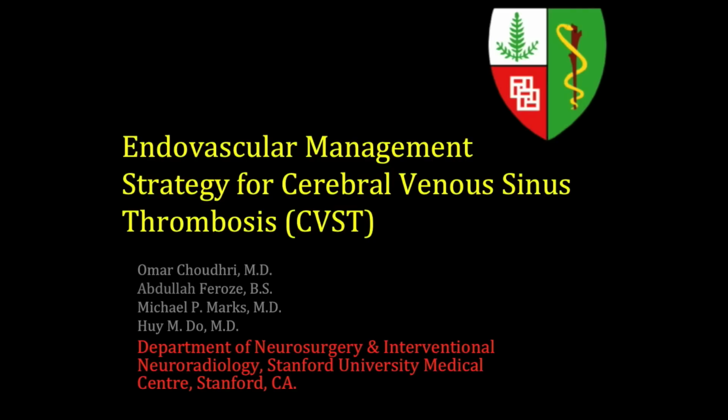The main goal for this video is to discuss the different management options available in patients that fail medical therapy in the setting of widespread cerebral venous sinus thrombosis, and to discuss potential options available to a neurointerventionalist in this setting, and additionally to discuss some of the techniques that we used in this particular case.